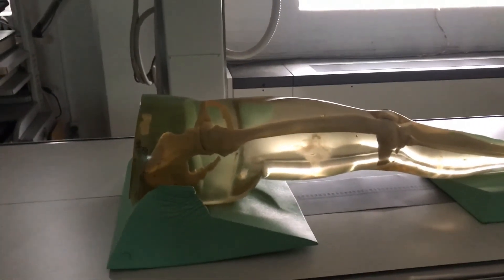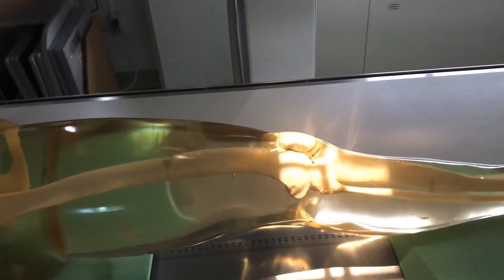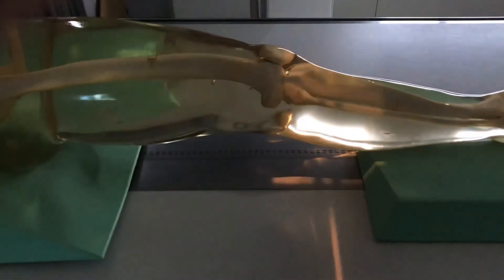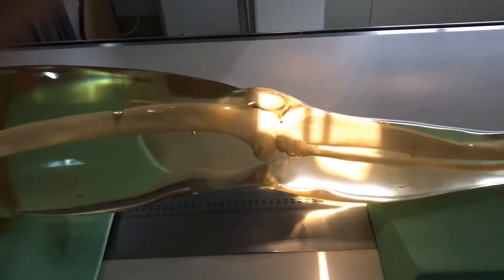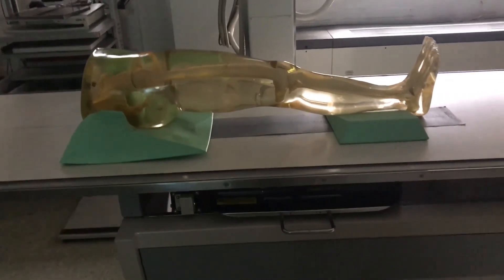When you need to do the knee, do not move your patient — you need to move the tube to the patient. So you'll most likely have to move your tube down. Don't take it out of detent, just come down with it. Line up right in the middle of your bucky tray — don't push in all the way. Center right over that knee joint for a straight-on AP. Bucky knee technique — say 8 mAs at 60, 10 at 66, or 12.5 at 70 for a bigger knee. Make your exposure.